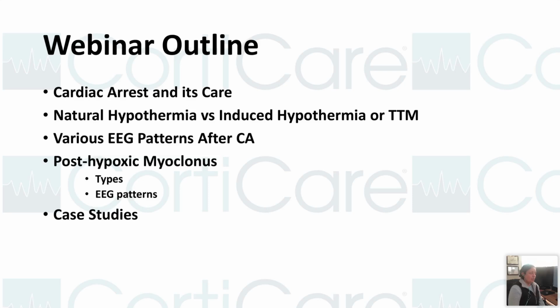So during this webinar, we're going to talk about cardiac arrest and the hypothermia, the targeted temperature management, various EEG patterns associated with cardiac arrest, and types of post-hypoxic myoclonus and the EEG patterns. There are a couple of case studies. If the time permits, I will definitely go over those. We did have this webinar under a slightly different topic, I guess 2 or 3 years ago from CortiCare.